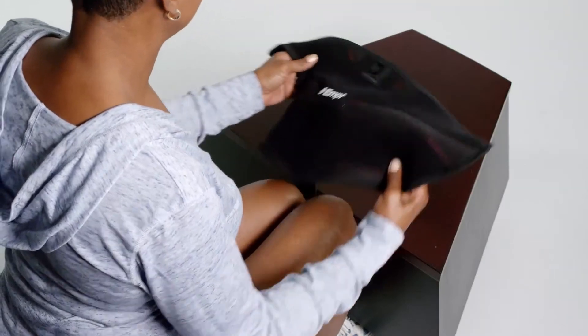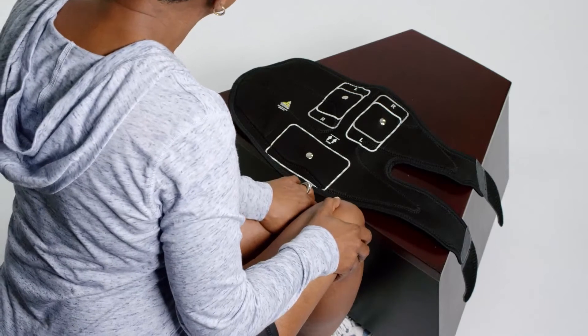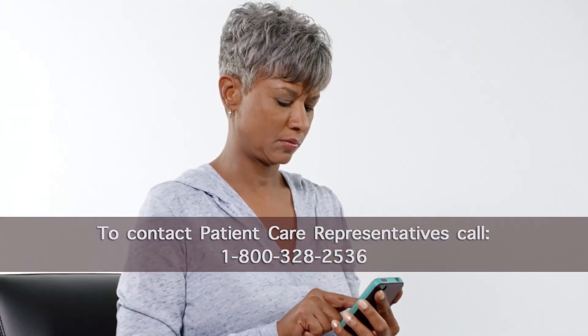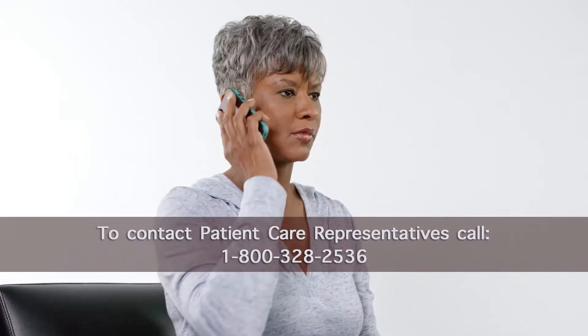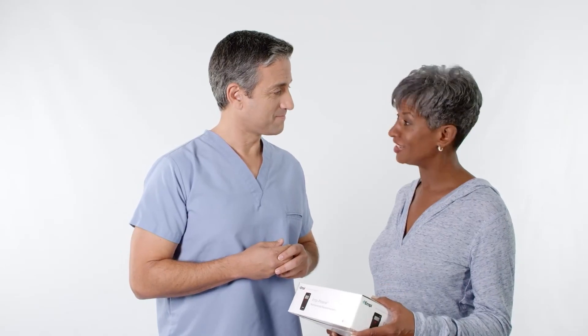When you reuse the device and accessories, always inspect them for signs of wear prior to use. When you need to replace electrodes or other items, contact our patient care representatives toll-free at 1-800-328-2536. Your healthcare provider may want you to bring this device with you to physical therapy. Use the device as directed by your healthcare provider. If you have questions about which program to use or how to place your electrodes, contact your healthcare provider.